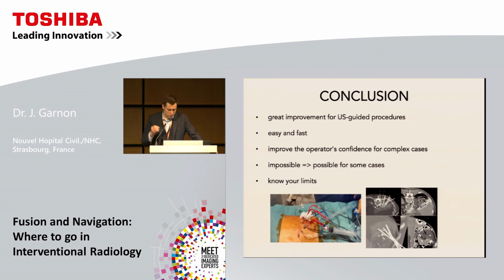However, if you perform more procedures using ultrasound guidance, your CT room will be available for other procedures which could be more complex.